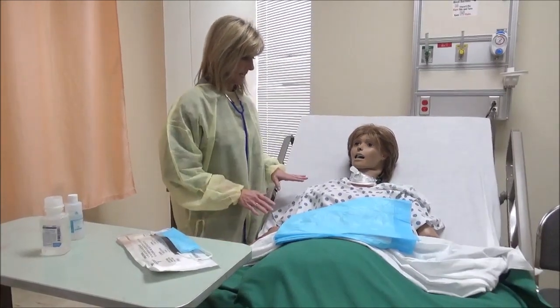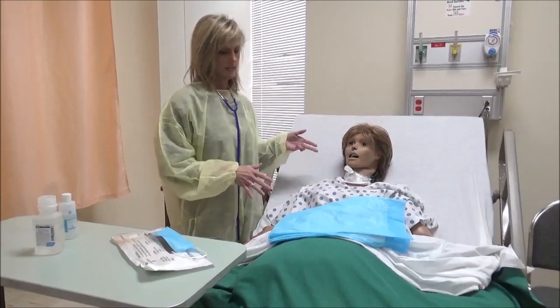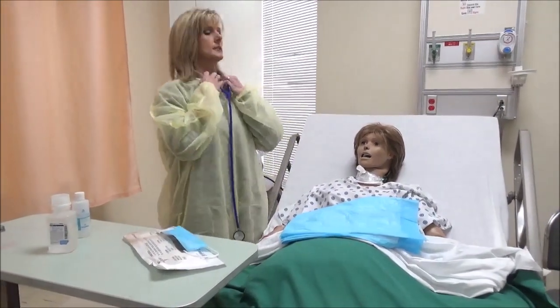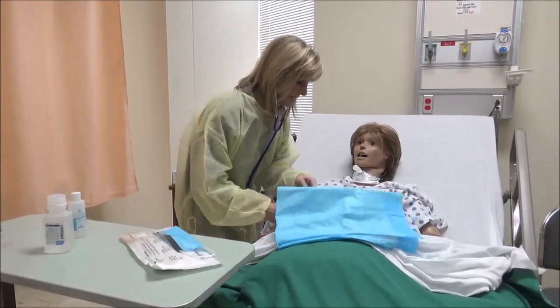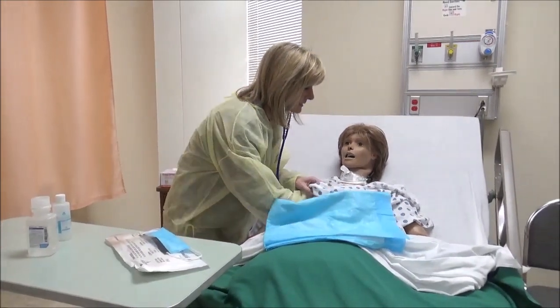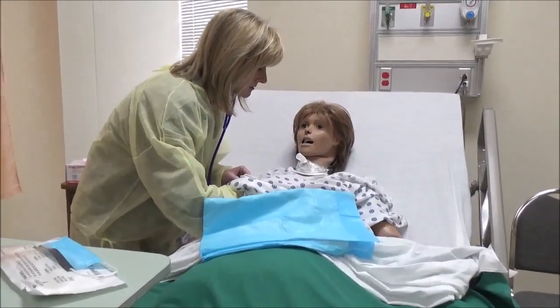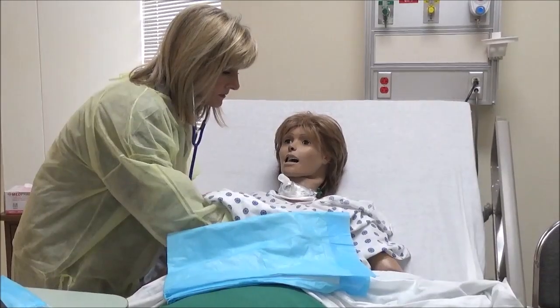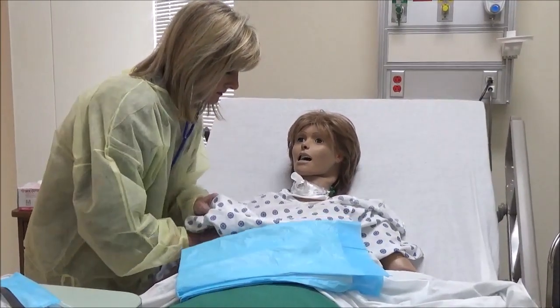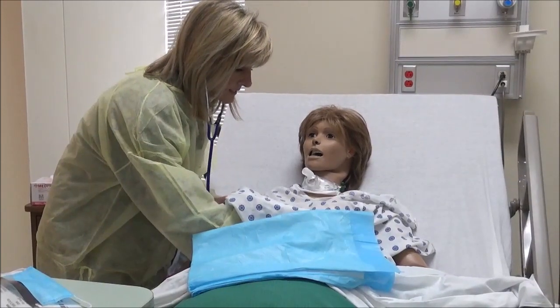So I've identified my client, I've explained the procedure to the client, I have the client in the correct position. Now I'm going to assess my client. So I'm going to listen to my client's lung sounds. I'm going to make sure that I get my stethoscope directly onto the skin and assess all lung fields. And I want to compare one lung side to the other. So in my assessment of the client, I noticed that she does need suctioning.